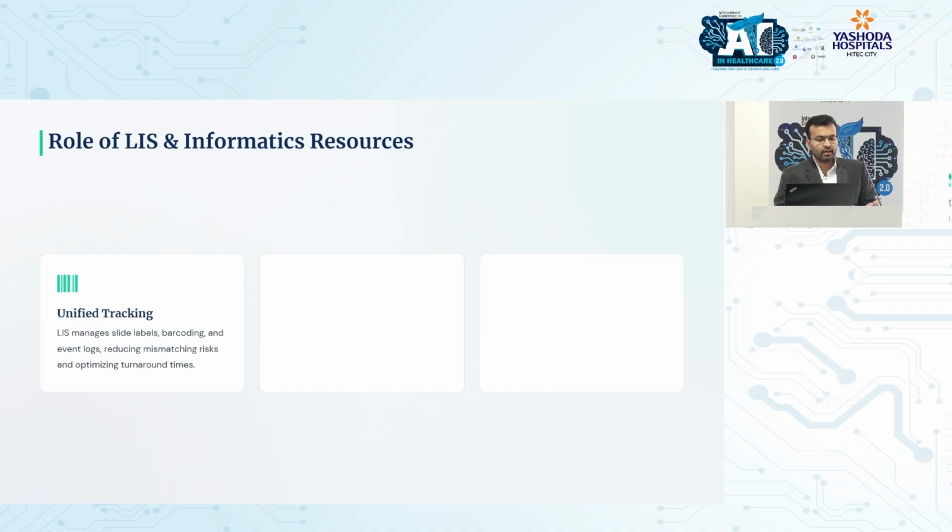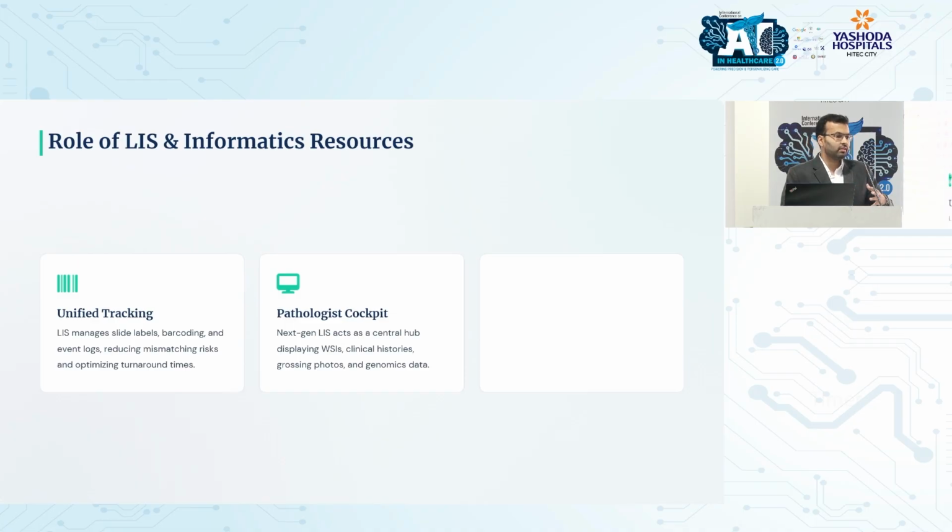So, role of LIS and informatics resources. There's unified tracking. That means, okay, so basically it means that each specimen comes with a barcode. You scan that barcode. That barcode is linked to your hospital's HIS. It pulls in all the information from there, pulls in what all tests have been ordered for that particular patient. Then based on that barcode, a histopathology number is assigned, and then based on the histopathology number, numbers are assigned for all the blocks and the slides that come out of it. So there is a continuous LIS tracking, which enables you to identify any slide faster, and it also prevents mismatch.